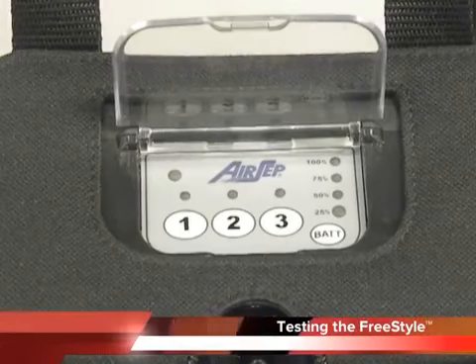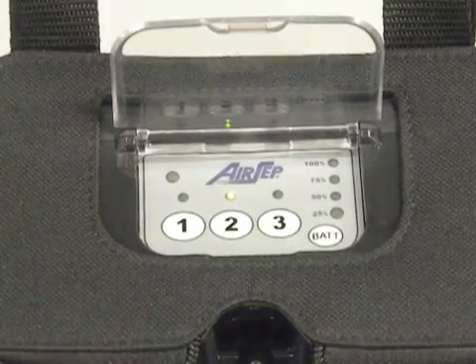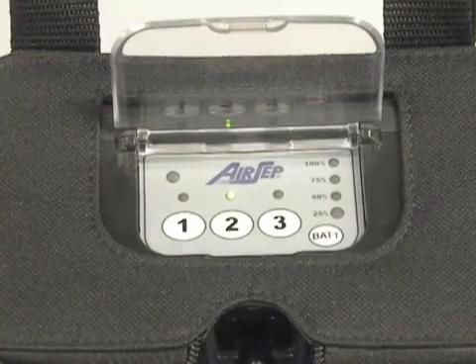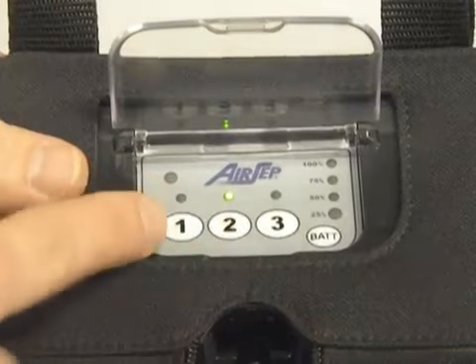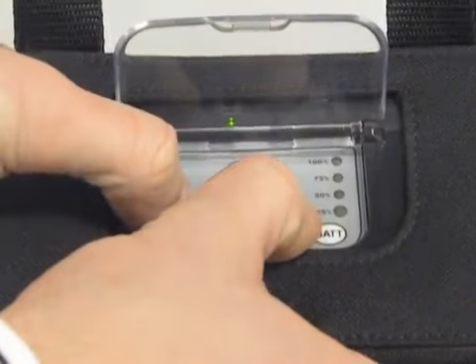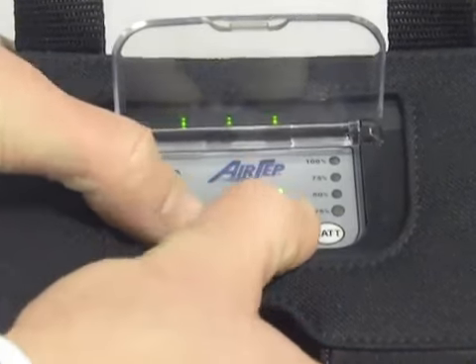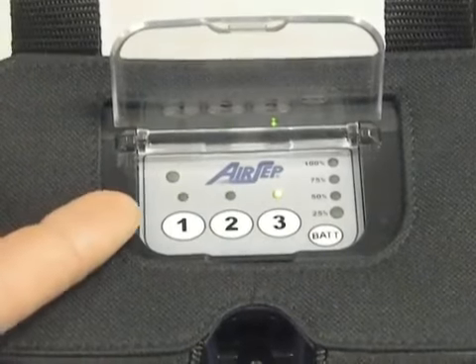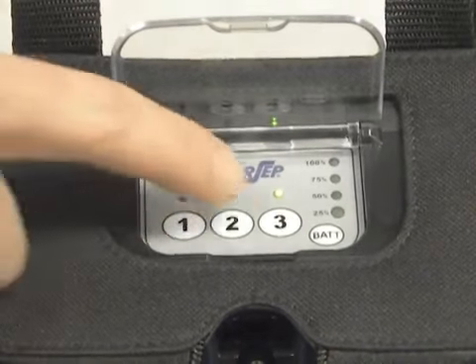To get the Freestyle unit into test mode, press the 2 button and let the unit warm up for about 10 seconds. Once the unit warms up for 10 seconds, you'll need to press the 1 button and the 3 button simultaneously and hold down for 5 seconds. All 3 LEDs will light up and the unit will begin auto-pulsing in pulse setting of 3 mode.